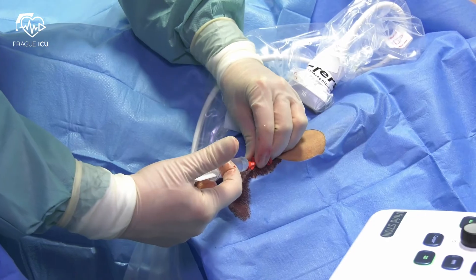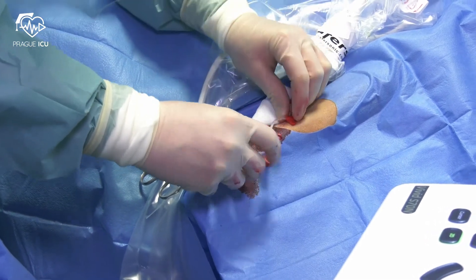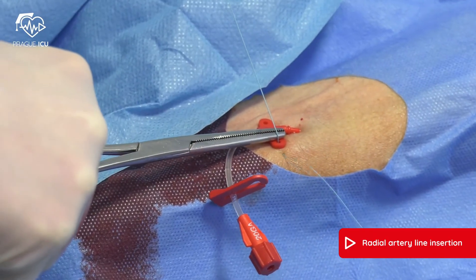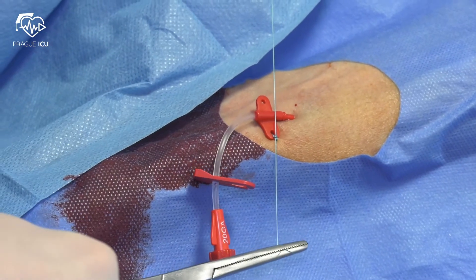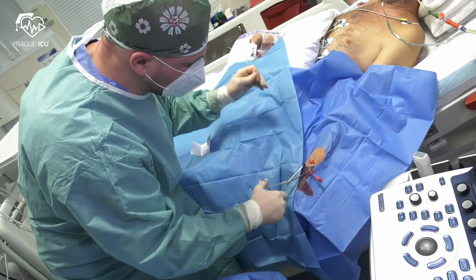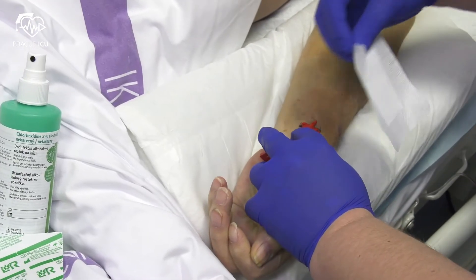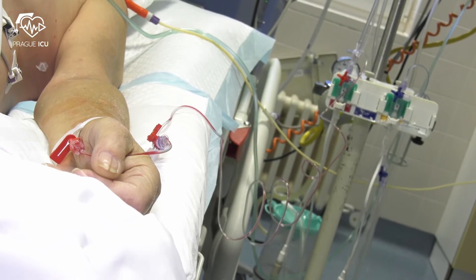Re-clamp and close the lumen with a sterile cap. Fix the catheter with sutures. Verify that the arterial waveform is appropriate. Apply a sterile dressing once the puncture site is not bleeding. Finally, verify that the pressure transducer is placed at the level of the patient's heart.